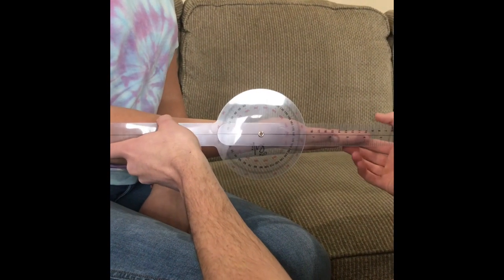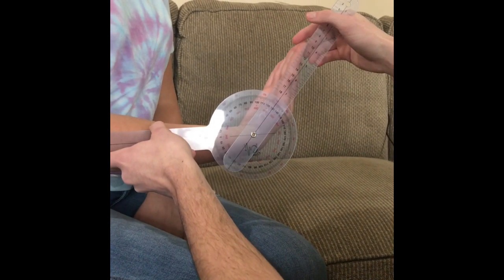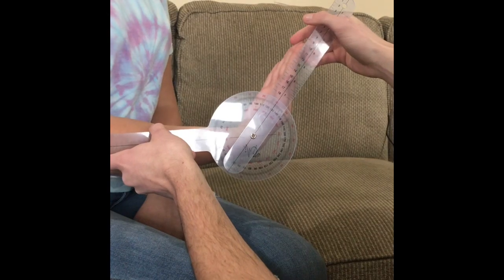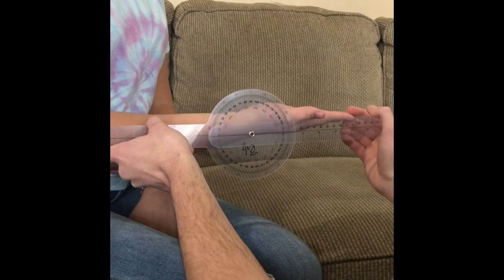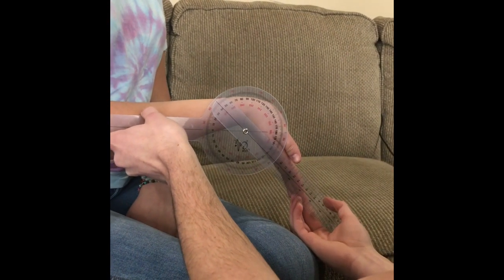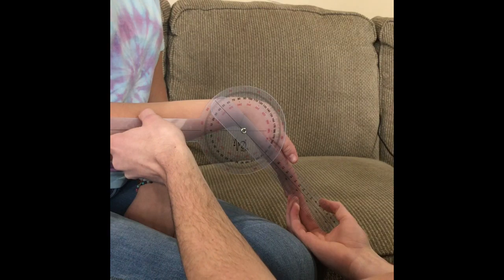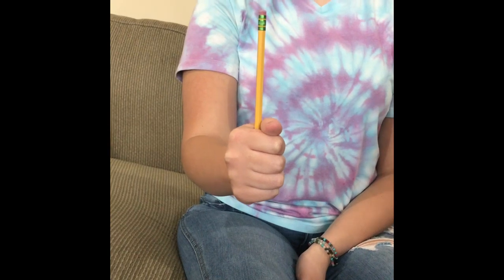So I'm going to have her move into wrist flexion, up like so. Make sure it stays equal. Good. That's about 50 degrees of flexion. And then we're going to move into wrist extension here. And that's at about 55 degrees of extension. Back to center.